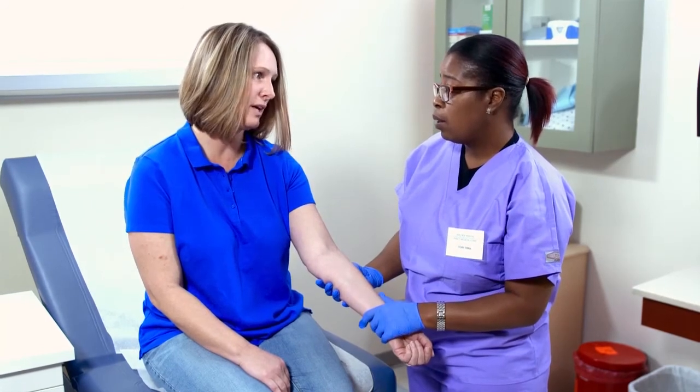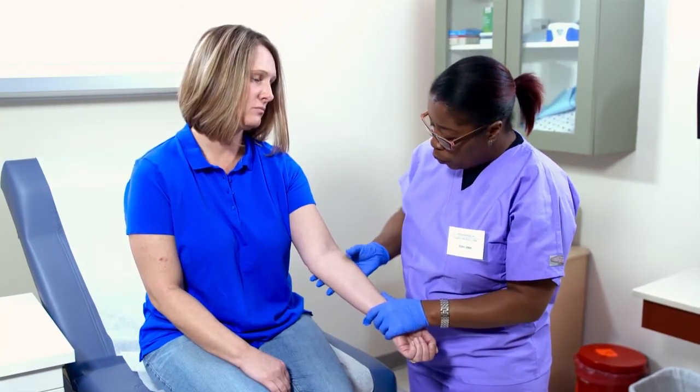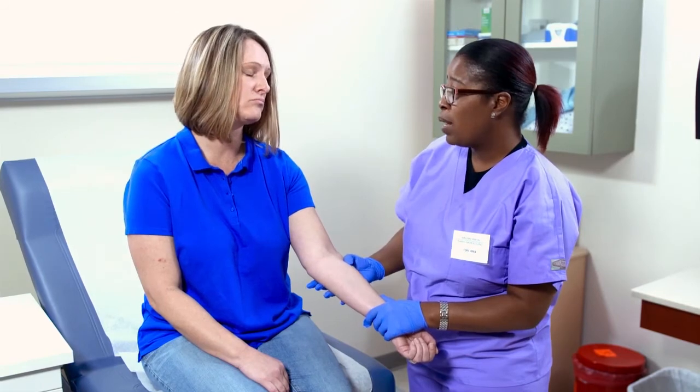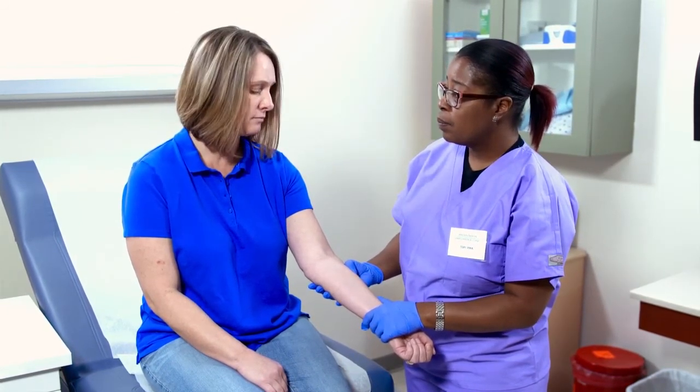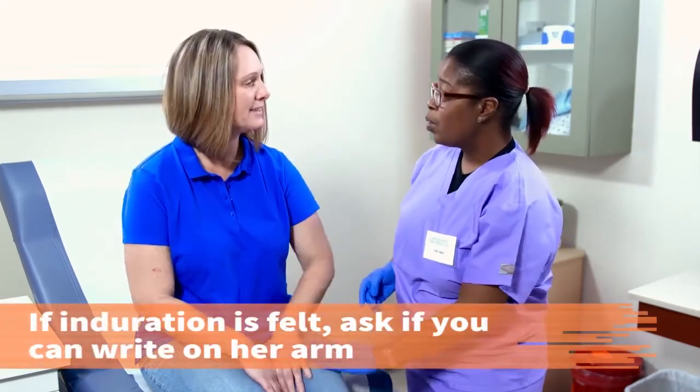Okay. And then what would happen? The doctor would order more testing to confirm that it's active. Gotcha. And then talk about the treatment process. Okay. If an induration is felt, ask the patient if you can write on her arm.